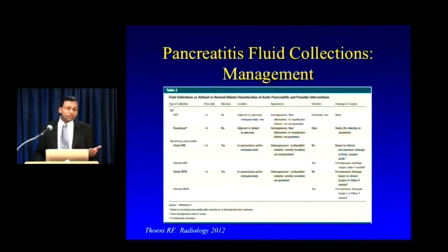And if you use the wrong term, at the very least, it may make you look bad in front of your referring clinicians. At the very worst, it may lead the patient to get the wrong treatment.